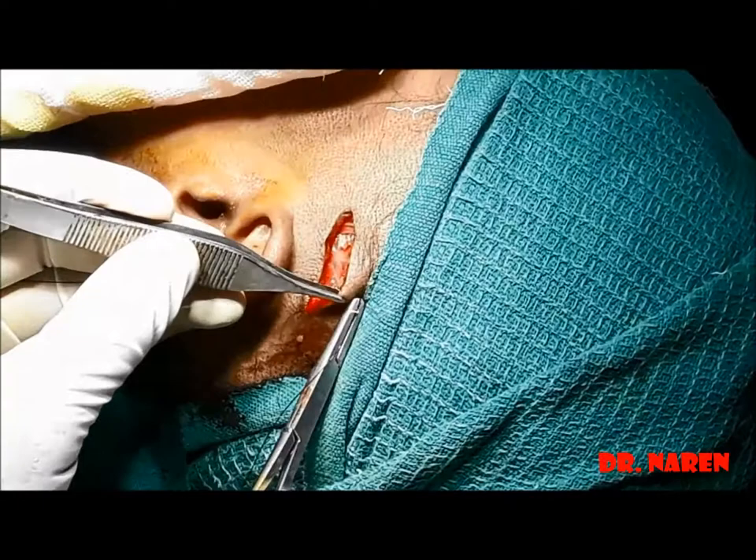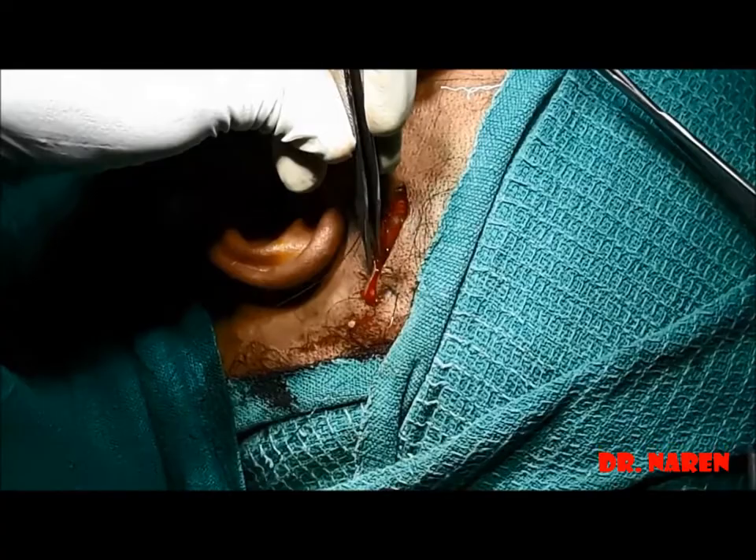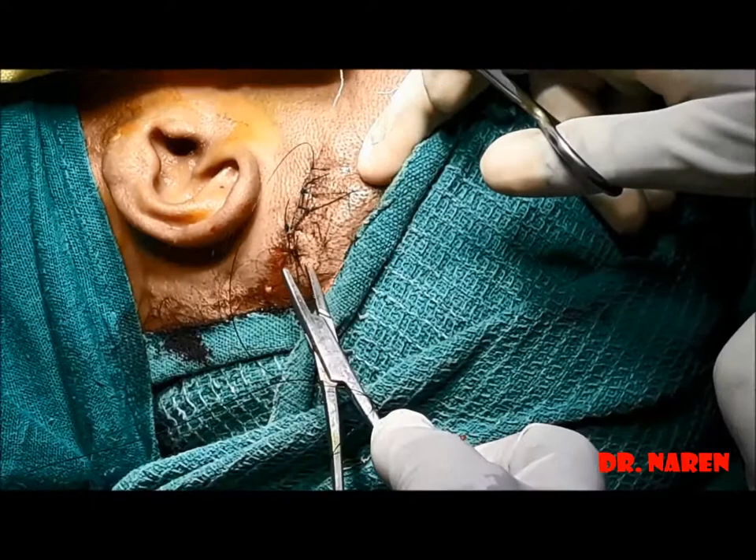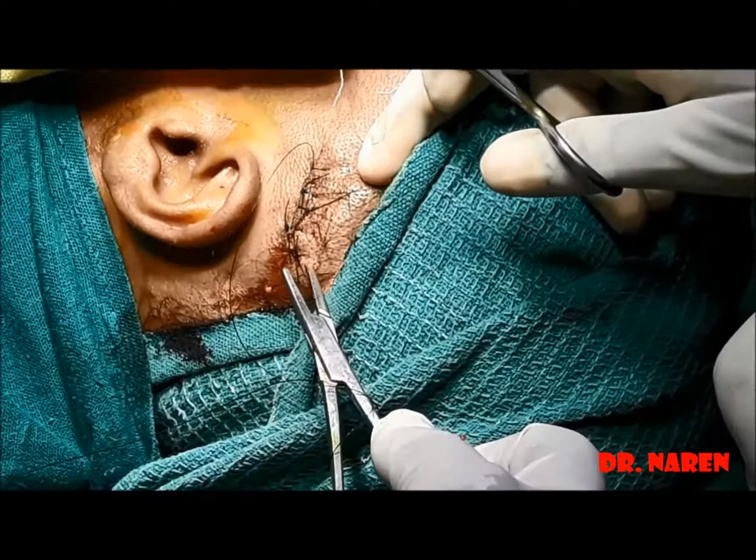The retractors are removed and the wound is closed with 3-0 Ethilon simple suturing, which is more than enough for this type of wound. For revision cases, the incision is made two centimeters superior to the helix so that we can access the remaining temporal fascia. I hope this is very useful for postgraduates of ENT or beginners. Thank you all for watching.